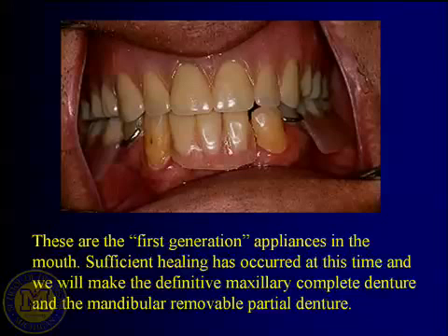Or the patient says, I liked everything about my old denture aesthetically, it just doesn't stay up very good anymore, and the back teeth have worn a lot. So it feels like it doesn't function so good because the back teeth are worn, and it seems like my gums have probably changed so the denture falls out more than it did. But as far as the looks of the teeth go, I'm pretty happy with the way my teeth look.